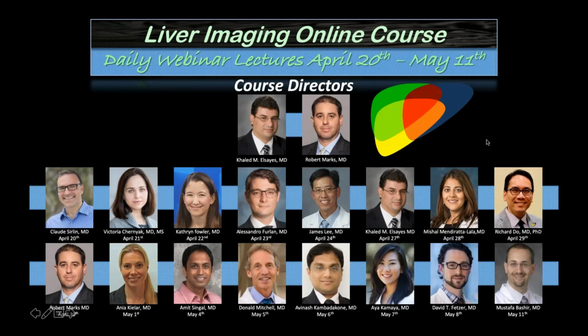I thought that was kind of interesting because once in a while I will get a case where there's such background heterogeneity, especially in advanced cirrhosis, areas of regeneration. You're trying to get a sense of what is the appropriate representation for washout. You can pick one area, obviously it could be somewhat similar. Another area might be perceived to be washout, making it more and more difficult on those cases. And I'm just wondering how people approach that.